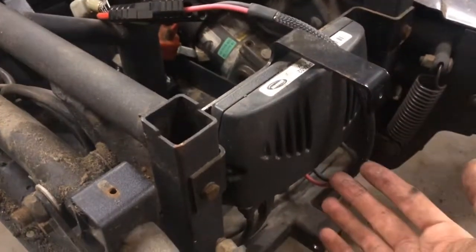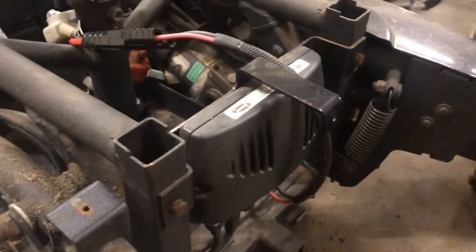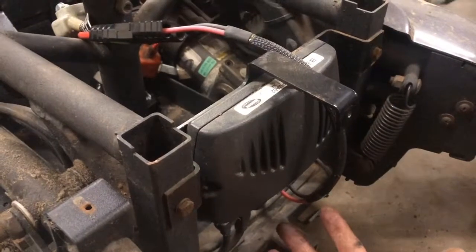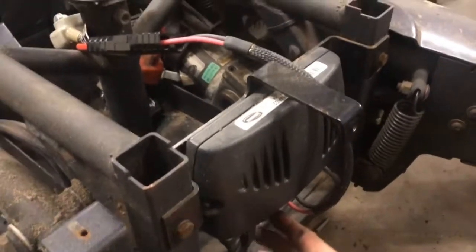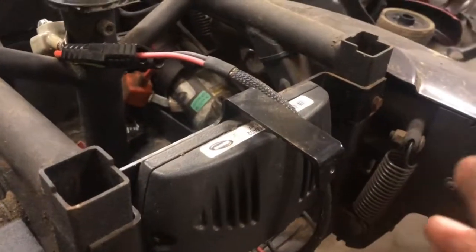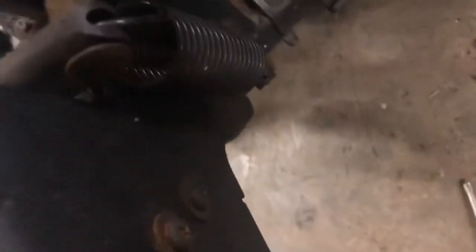So we run into that sometimes, and now we got to the point where we don't even look at it anymore. I know in your case, you have to trust it. In our case, we have parts laying around, we can just throw it on there. So anyway, before you take your chair apart, if you bought some motors off eBay, just hook it to this to see that it's what it is, and then start doing all of this. It's just really good advice. Okay, so you can follow your cord if you're just doing one motor. You can actually see which one it's plugged into, because you would have two. So go ahead and follow your cord.